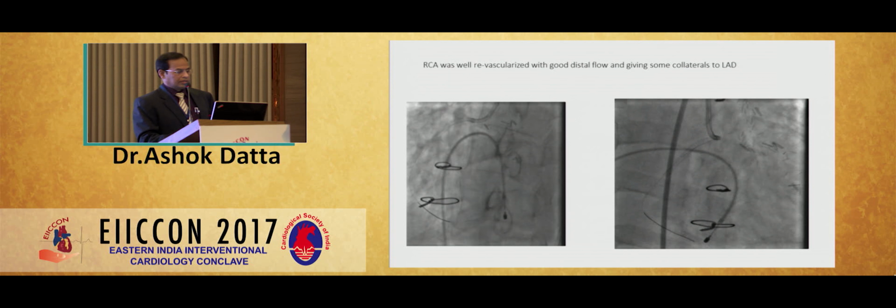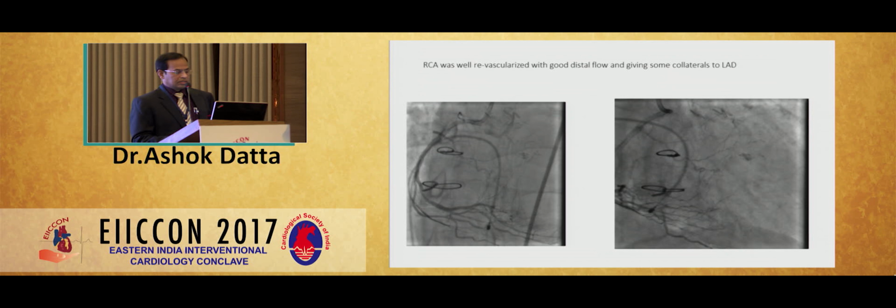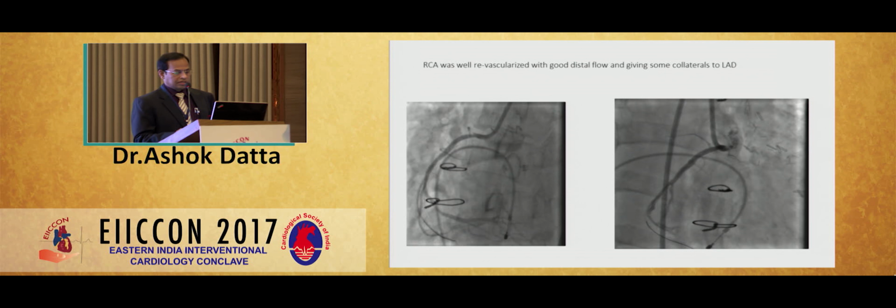And you see there is some collateral from the right to the LAD.